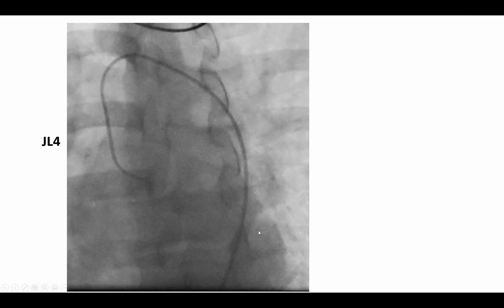When you see this catheter, from a femoral access, from any access, you see a catheter looking like this, and I'll tell you it didn't engage the left coronary. This is a still frame. You don't need contrast injection. Just by looking at that catheter, and I tell you I couldn't engage, what's the immediate next step to engage the left coronary artery here? Think about it and give me the answer. What's the immediate next step when you see this catheter?